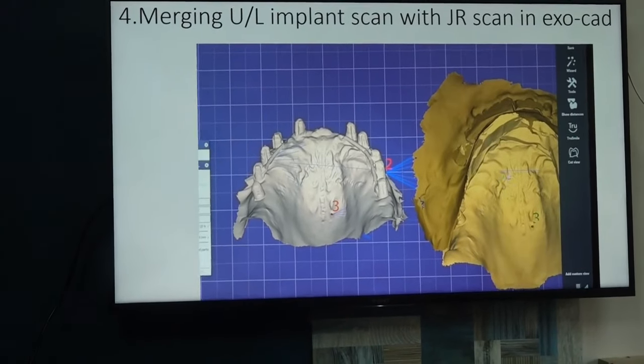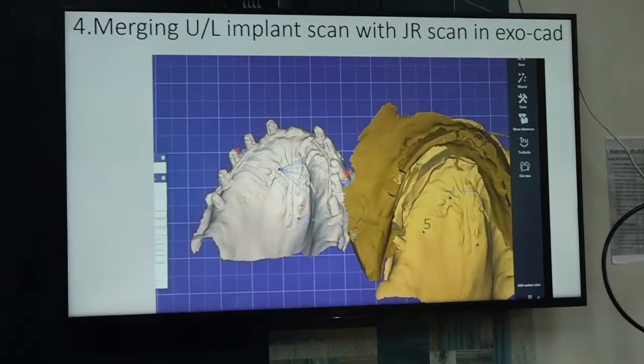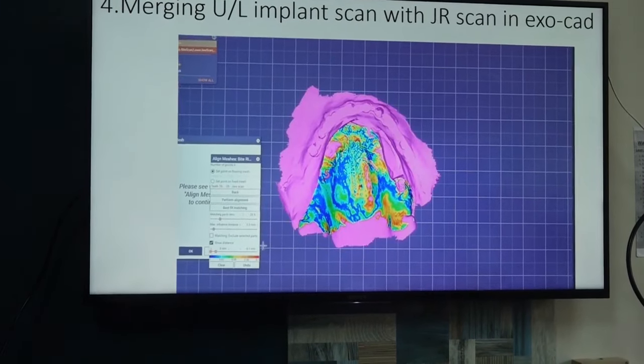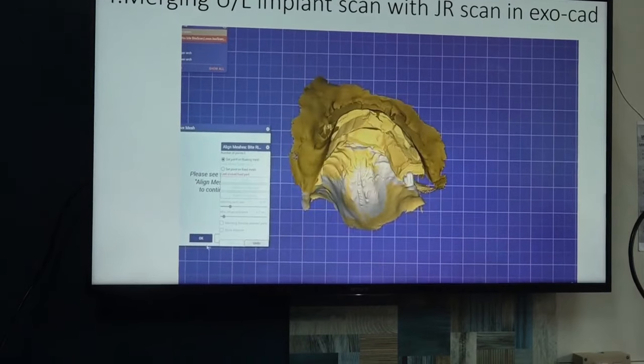So how many landmarks do you need? Four. Three enough. Three is enough. Sometimes you may need extra.